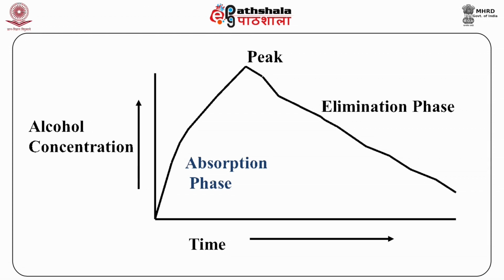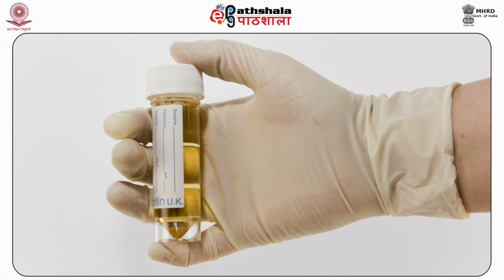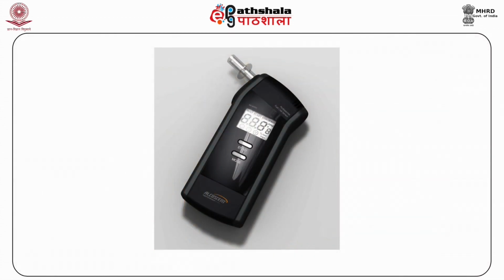Alcohol intoxication can be legally defined by the BAC, but the idea of drawing blood from the vein of a driver of a vehicle to determine whether he is drunk or not doesn't seem to be practical. Urine tests too proved to be equally impractical as blood sampling. This gave rise to a need for an instrument which could overcome this problem. Breath alcohol testing devices serve a very useful purpose as they use a sample which is easily obtainable, along with a rapid and accurate result.